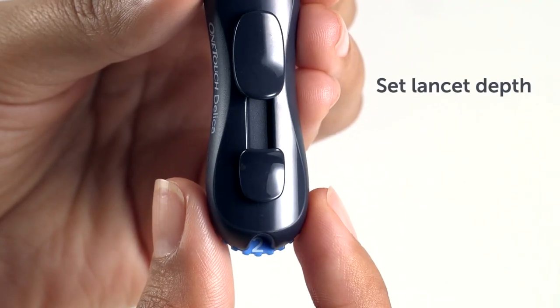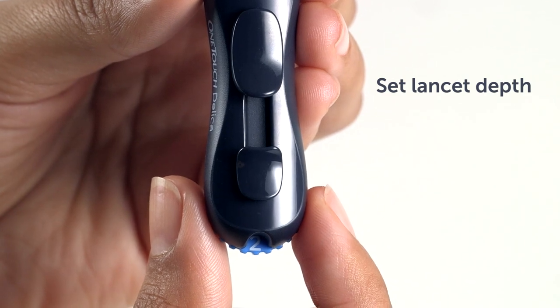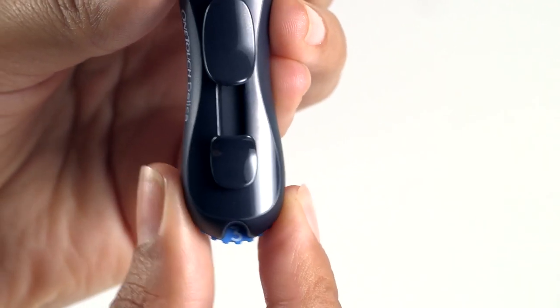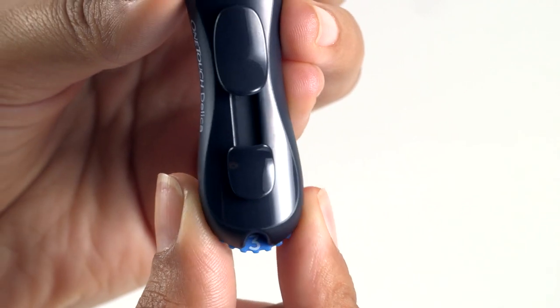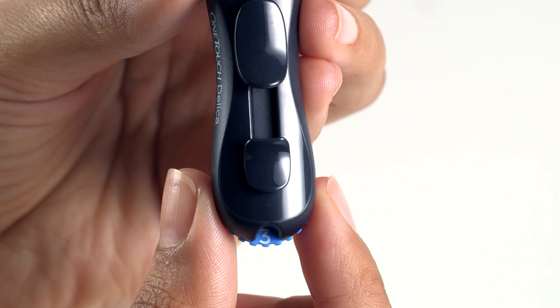Turn clockwise to secure the cap. Do not overtighten. The OneTouch Delica lancing device has seven depth settings to allow for personal comfort. Just turn the depth wheel to your desired setting. One is the shallowest and seven is the deepest. A shallower finger puncture may be less painful, so start small and increase until you find the right setting for you.